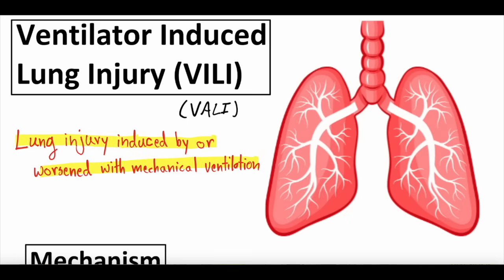And the reason this happens is mechanical ventilation is not a treatment or a curative for any disease. Mechanical ventilation is simply to buy you time. This is where you get a breathing tube. You have endotracheal intubation, you get put on a ventilator. And that ventilator is essentially what oxygenates you and ventilates you. It gets oxygen in your body and gets rid of carbon dioxide.